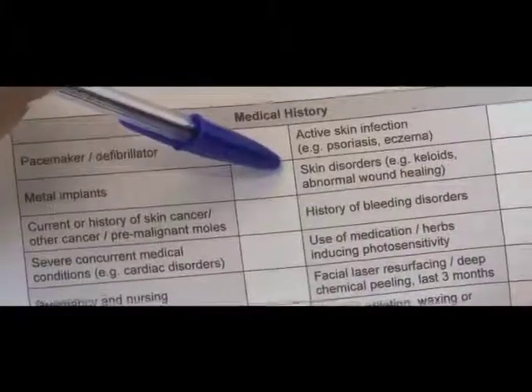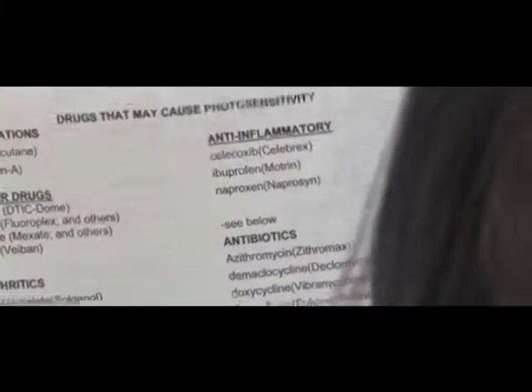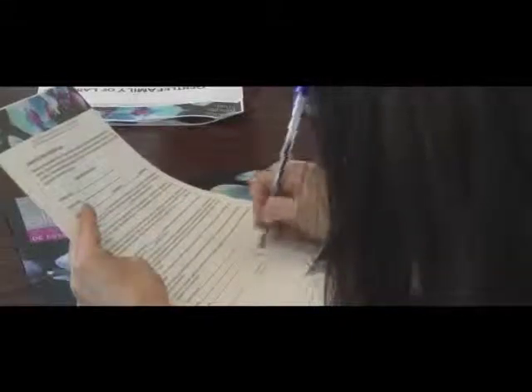For any laser treatment, it is important to have a complete initial consultation with the patient to review the patient's medical history, including medications. Select the proper skin type of the patient, complete a physical examination, review contraindications, and discuss the treatment process. Establishing appropriate and realistic expectations prior to the treatment is important. The informed consent should be reviewed and signed. Pre-treatment preparations, such as advice regarding sun exposure and post-treatment care, should also be considered and discussed.